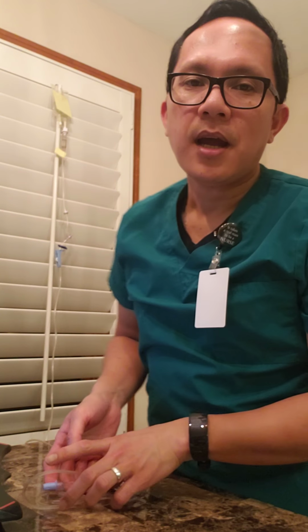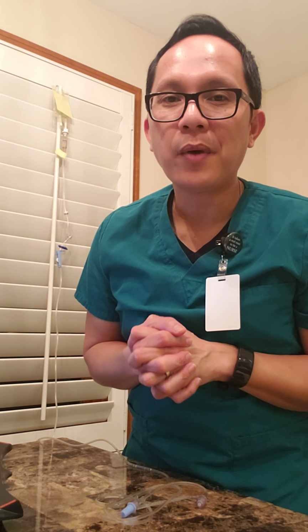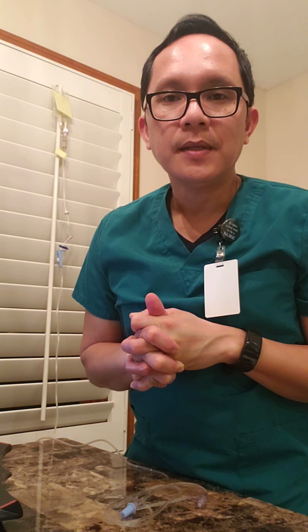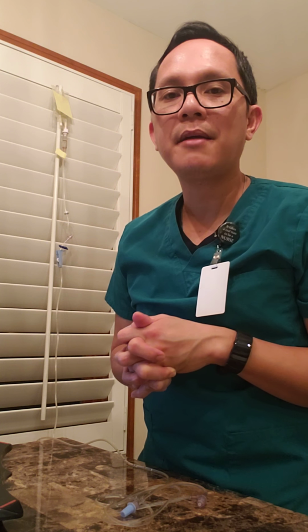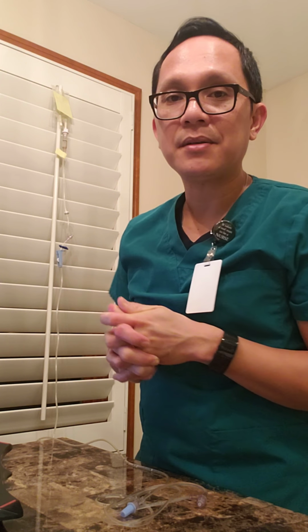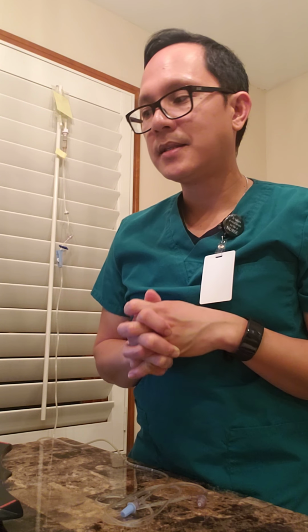Once I get to my patient's room, I want to make sure I perform hand hygiene, wipe down the equipment, and provide privacy. I want to make sure I do my third check for my medication and compare it to the MAR: the right medication, the right dose or the right IV volume, the right patient, the right route, and the right time.